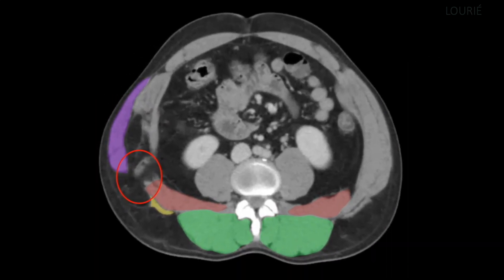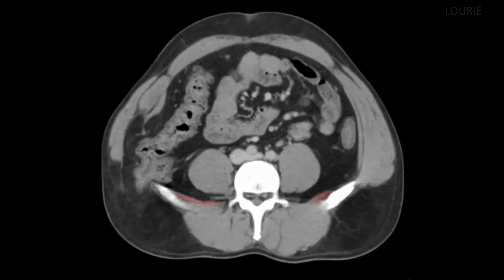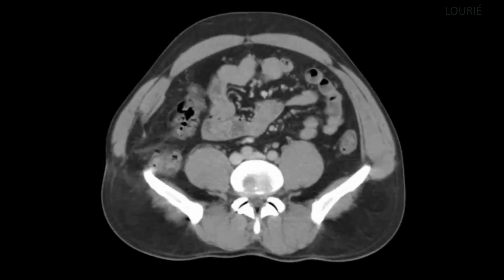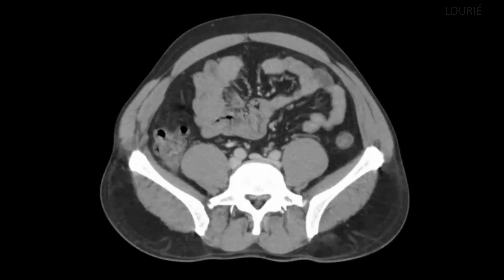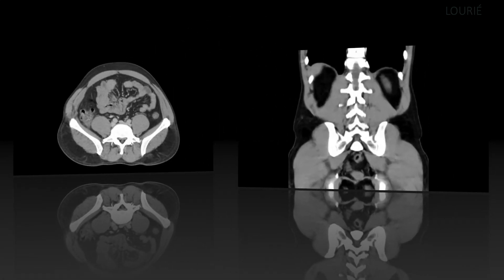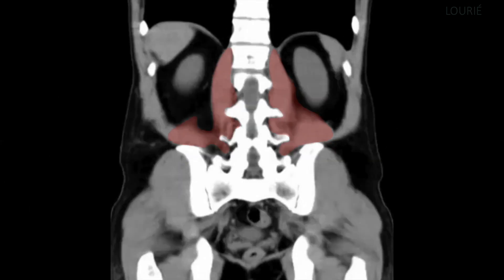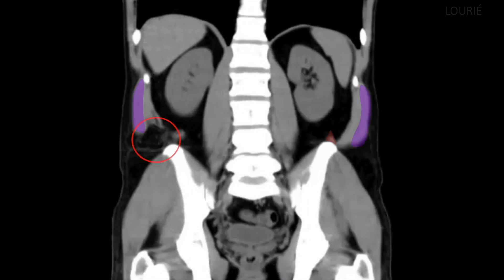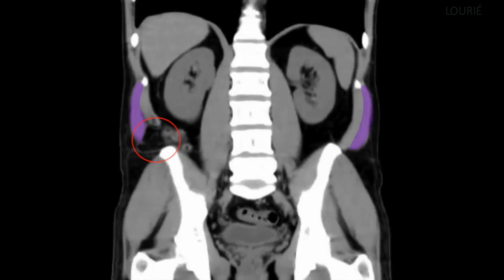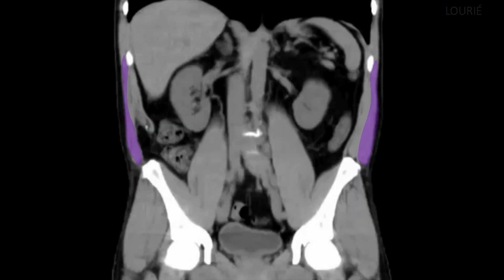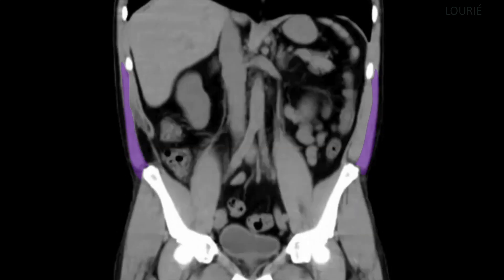As we continue to scroll down in the Petit's hernia, you can see bowel herniating with contact with the iliac crest, the last bits of attachments of the quadratus lumborum bilaterally, and the internal oblique floor has been disrupted. Moving more anteriorly, all of the obliques are attached to the iliac crest. In the coronal view of the same patient, looking at the quadratus lumborum, you can see Petit's hernia above the iliac crest, and moving anteriorly, the external obliques are attached to the iliac crest.